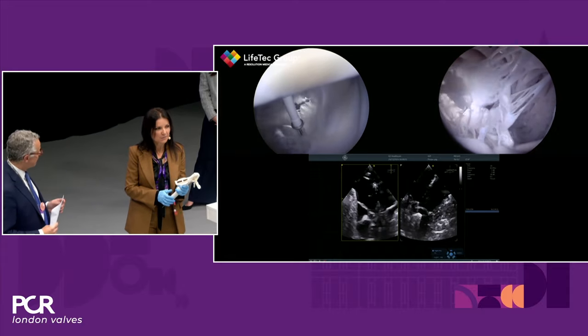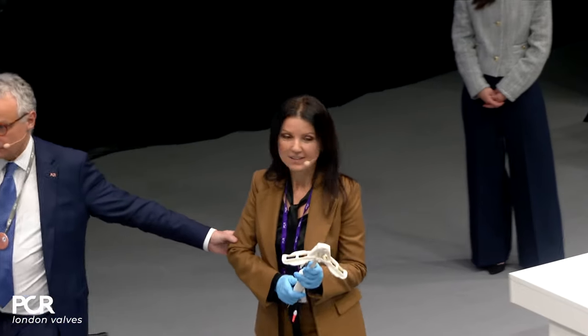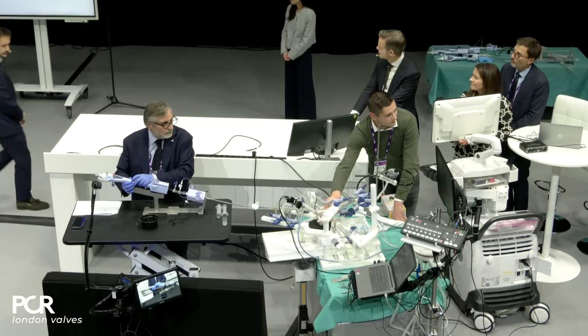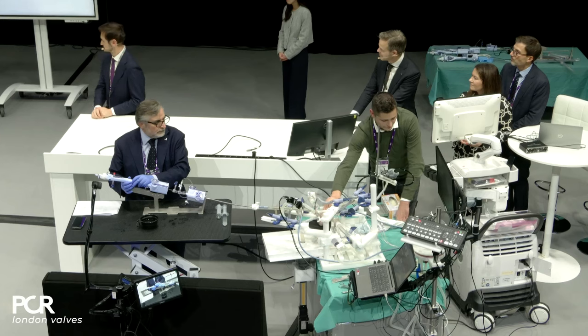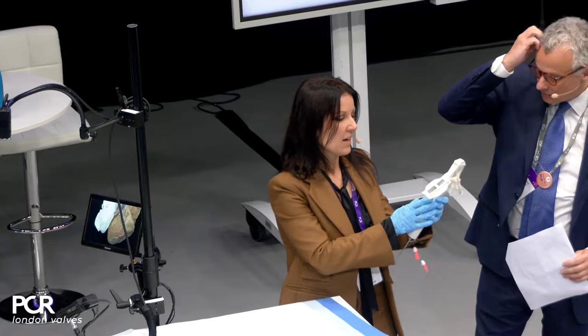So there is a key feature in the TriClip device that ensures safety and efficacy on the tricuspid valve. And that key feature is the gripper. Our gripper, which is this element here, is made out of a nitinol material. And it has frictional elements. Those frictional elements are these little points here.